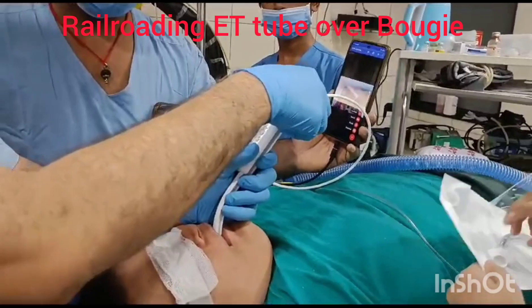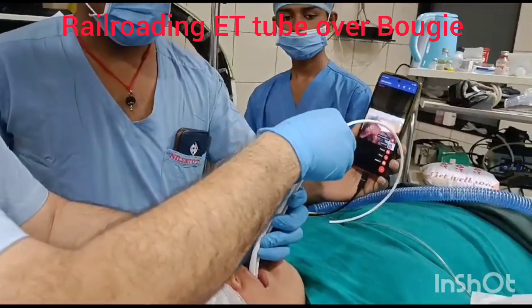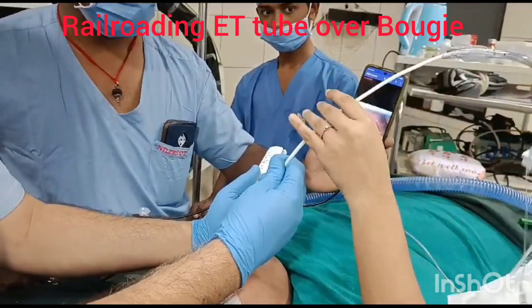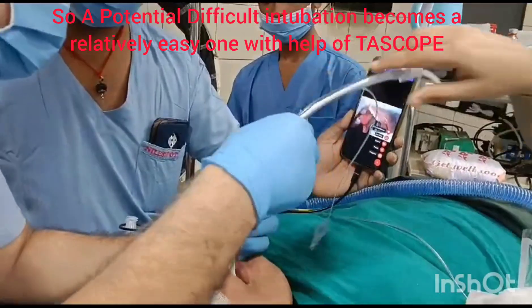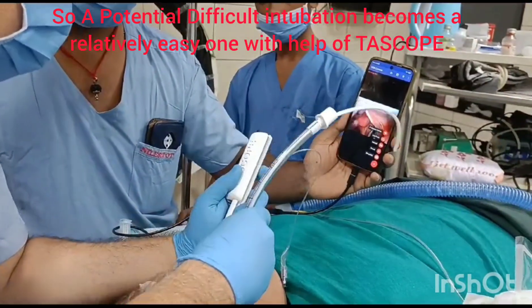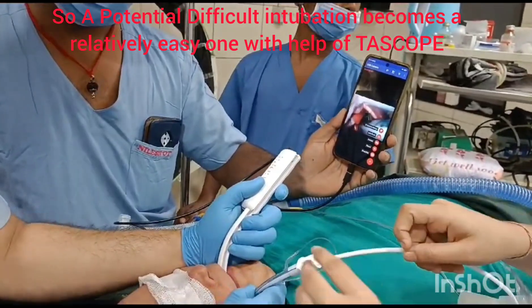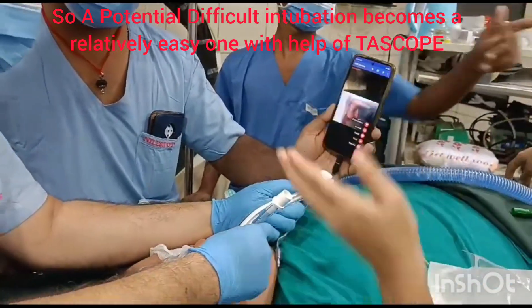Putting in the bougie inside — bougie has entered. Now over the bougie we are railroading and rotating the tube under vision. The tube is entering into the larynx.